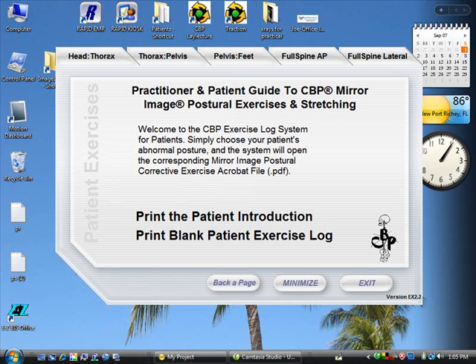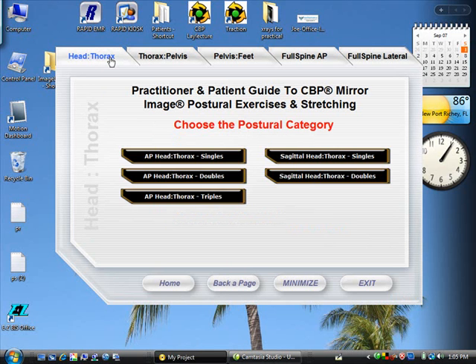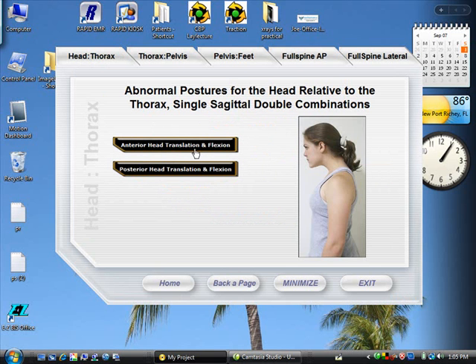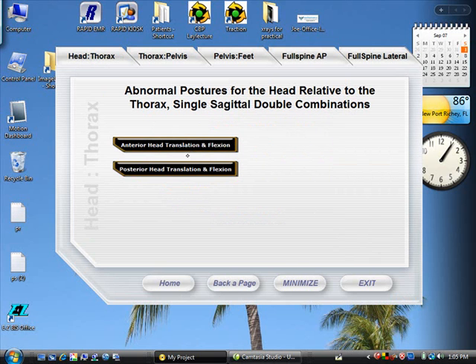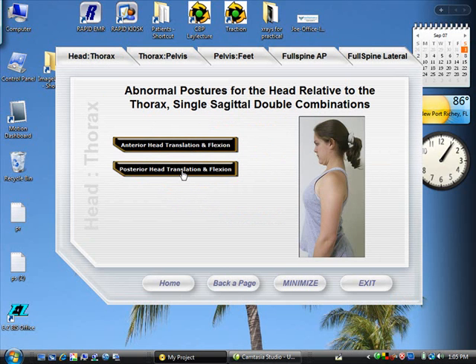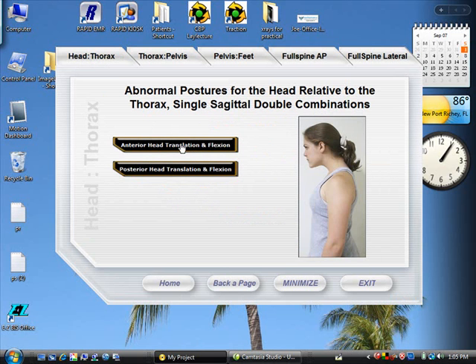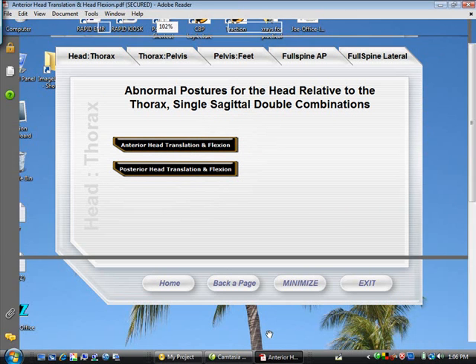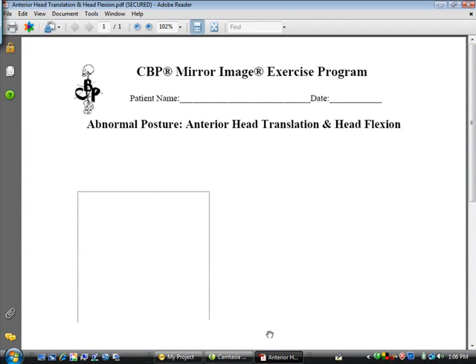For instance, if they have an abnormal sagittal posture — say anterior head translation in flexion, or posterior head translation in flexion — let's say most of your patients will come in like this. You just click this and it will open up the PDF file that you will prescribe to your patients.